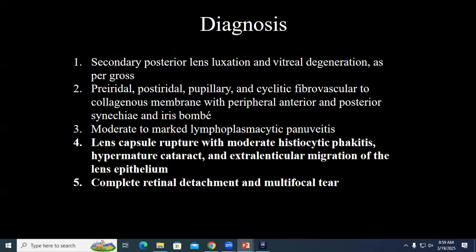And basically what I would say is that if you don't see the amyloid carpets, it may just be that in some other quadrant somewhere, maybe I would find it. So I'm not sure I can necessarily rule out equine recurrent uveitis in this case, but at least the findings weren't specific or pathognomonic for it. So just some interesting stuff. Mainly the interesting thing about this case is signs consistent with trauma. And that's all I can say about this horse.